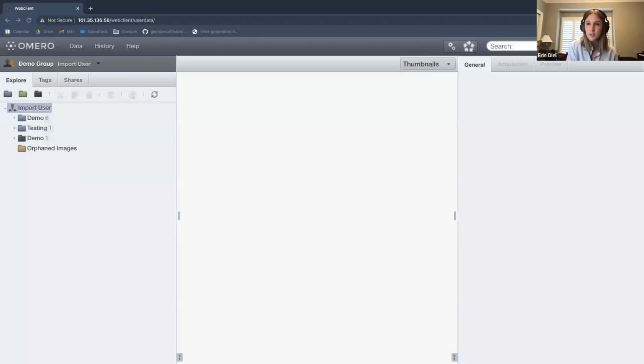Okay. So what I'm going to share today is not your own UNC OMERO server. This is one of our demo servers, so just be aware of that. The data won't look exactly the same as what you see when you log in, but I will hopefully show some generic enough examples that you can apply it to your own workflows as well.